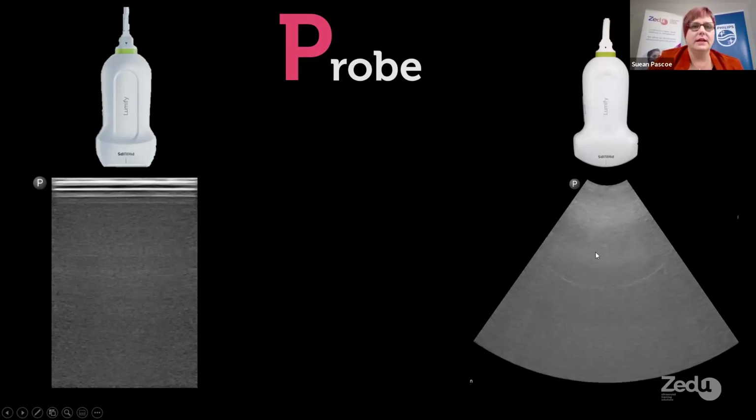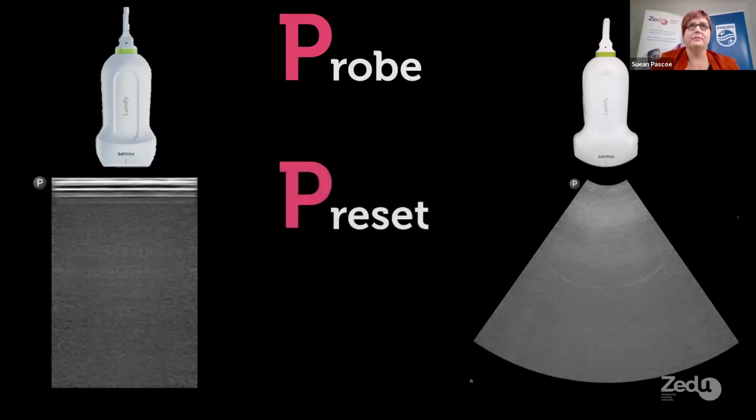And so you do need to keep the curved probe on standby. It's good for getting a whole overview and being able to see both poles of the testis in its true length to be able to make a measurement. But the detail on the curved probe, because it's lower frequency, is not that great. So choose the right probe for the job. You want to set your preset, so if your machine has a testes preset, use that. Otherwise, small parts or an MSK or something that's a superficial setting.